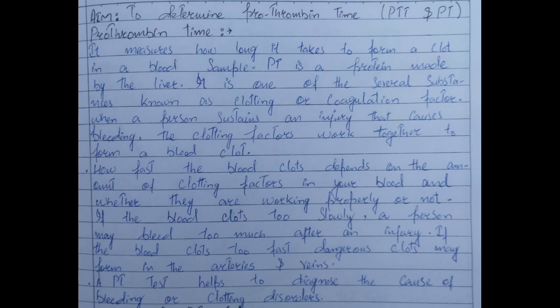ठीक, how fast the blood clots depends on the amount of clotting factors in your blood and whether they are working properly or not. If the blood clots too slowly, a person may bleed too much after an injury. If the blood clots too fast, dangerous clots may form in the arteries and veins. A PT test helps to diagnose the cause of bleeding and clotting disorders.